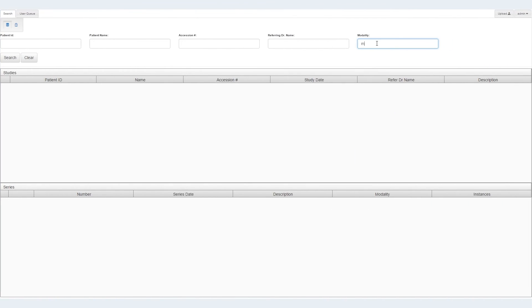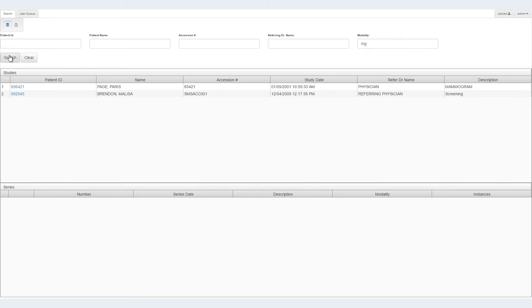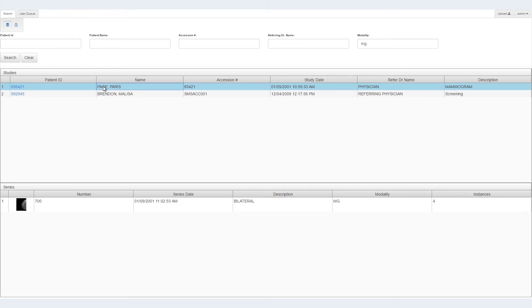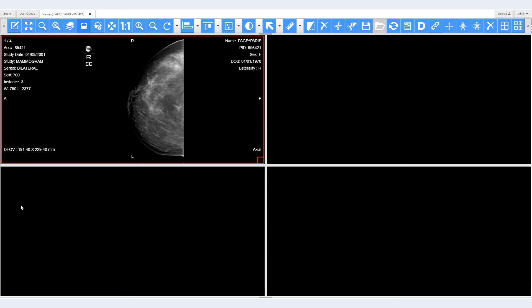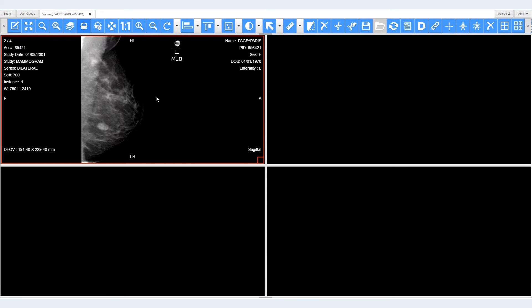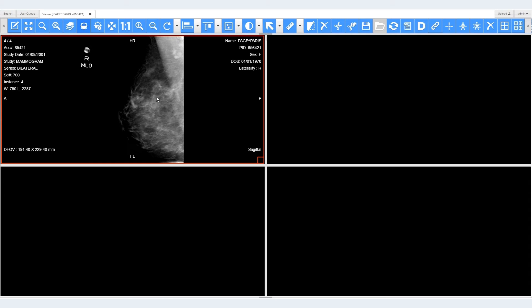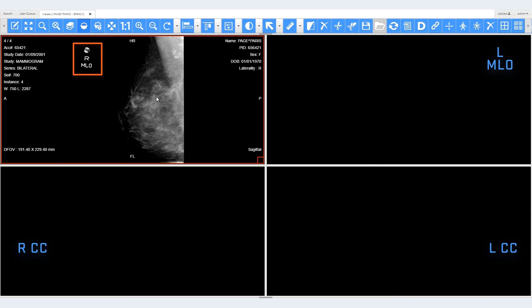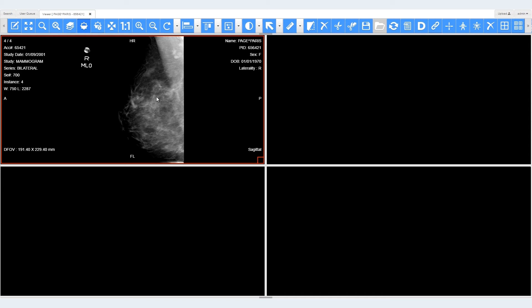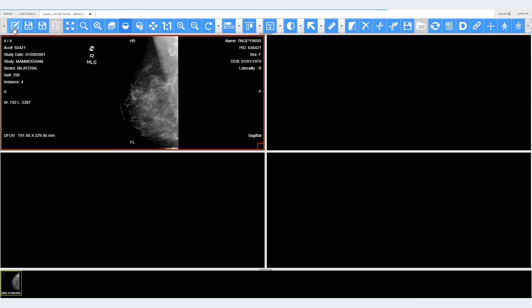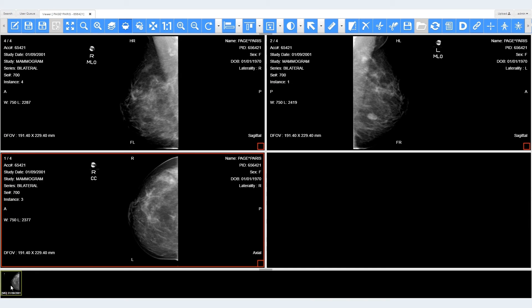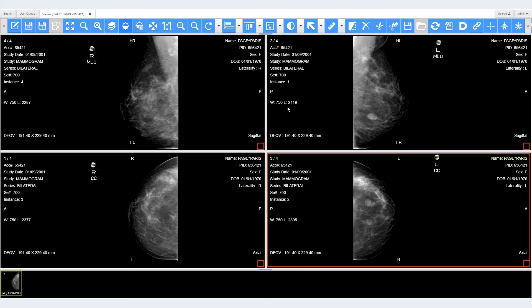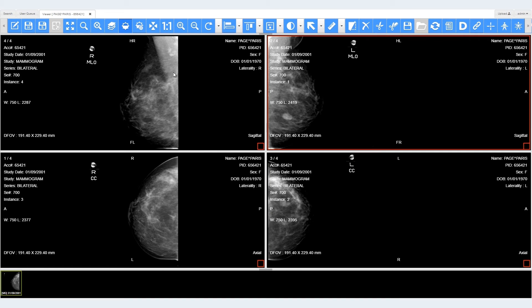Let's take a look at how this works in the LEEDTOOLS HTML5 Zero Footprint Medical Web Viewer. First, we will search for a patient and find a study with 4 images. For each mammogram study at this practice, the same 4 images are always taken, but stored as a series where each frame can only be viewed by scrolling. The user would prefer to view these images at the same time and in specific locations, so we will create a hanging protocol to do so.